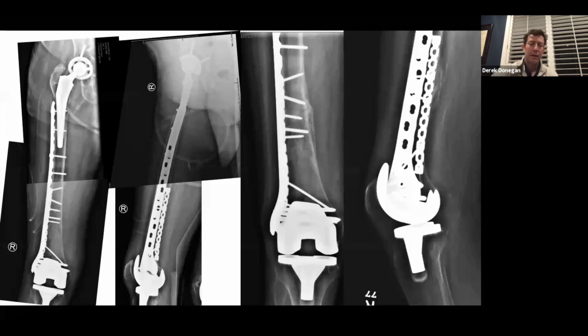And I think that the other comment on the remodeling distally is you sometimes get the same remodeling proximally around the femur. It can have some varus remodeling around the hip stem, which makes it challenging. But the lateral view is a great way to see how much room you have around that stem, if you're going to have trouble getting your fixation proximally. But I think this is a nice construct.